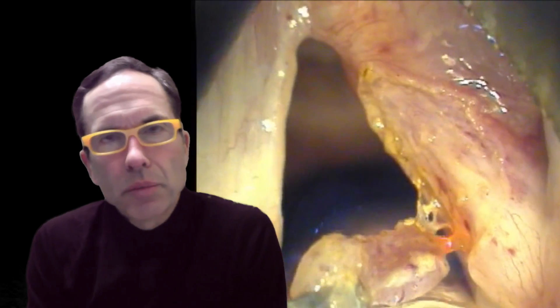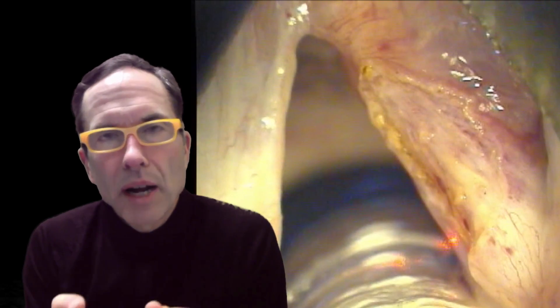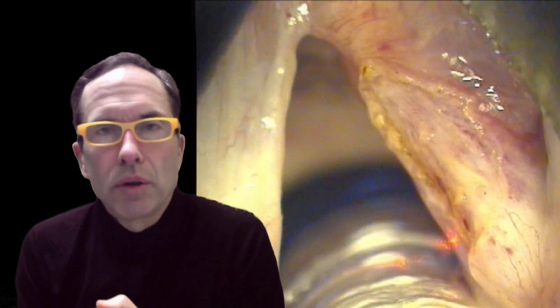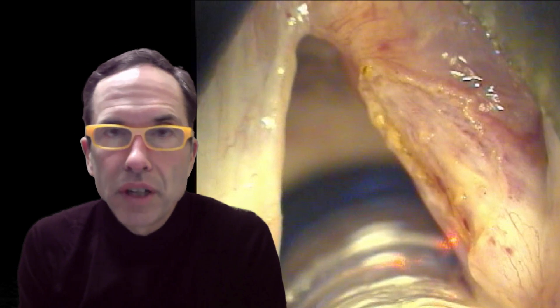I finished excising the lesion by cutting through the far side of the mucosa and sending it to the pathologist. The report is going to say all margins are positive, but I'm not concerned about that for two reasons. One is that I know I cut on normal mucosa and it was only the edge of my laser hitting the tumor. The second is that I don't decide how much to take out by the pathologist report, but rather by close follow-up to see if it recurs and catching it at an early phase if it does.